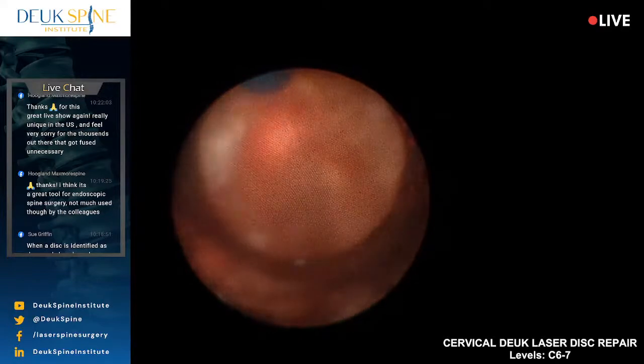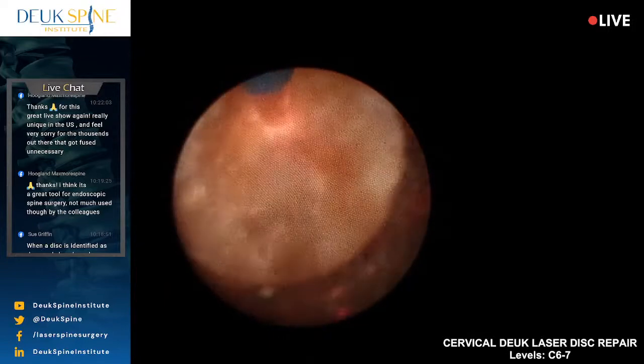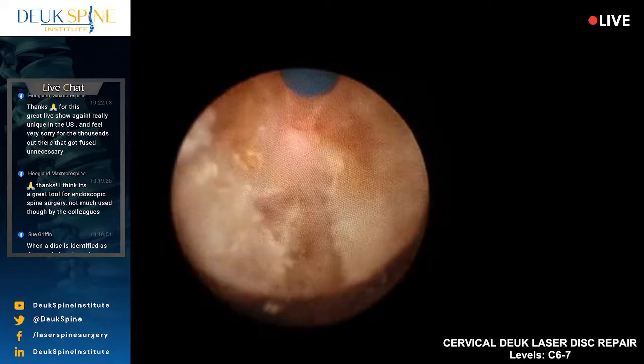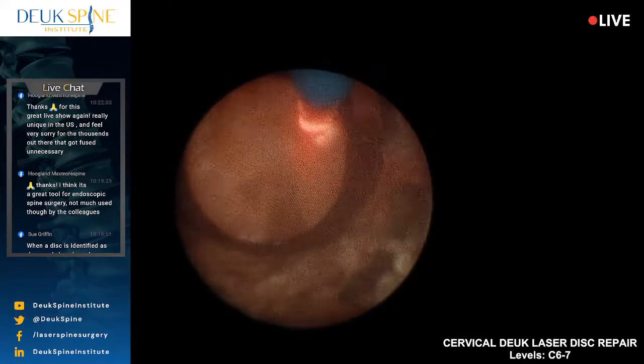Now this is a bone spur sitting on top of his nerve. Yeah, it's better. Thank you. All this junk has literally just cluttered up the foramen.